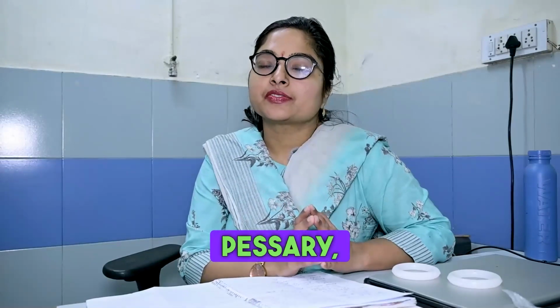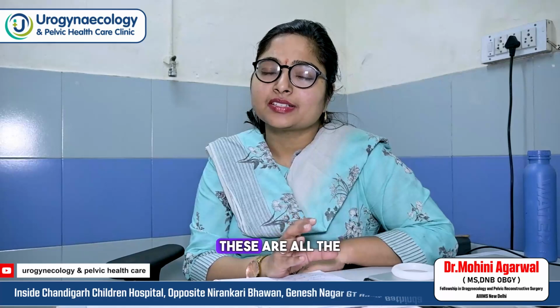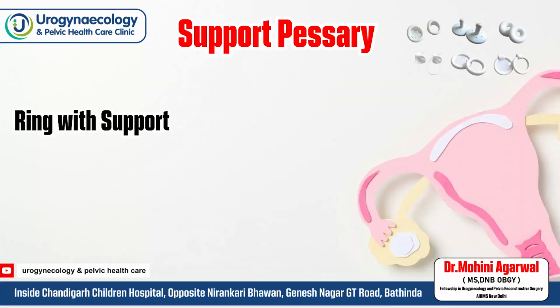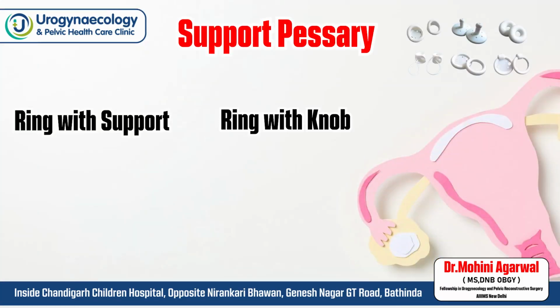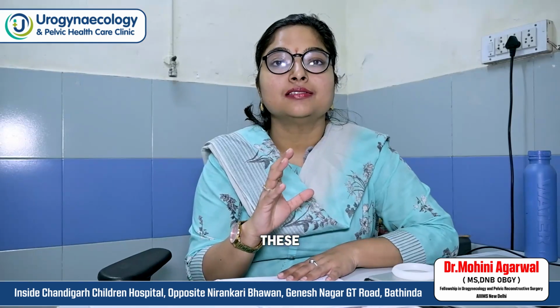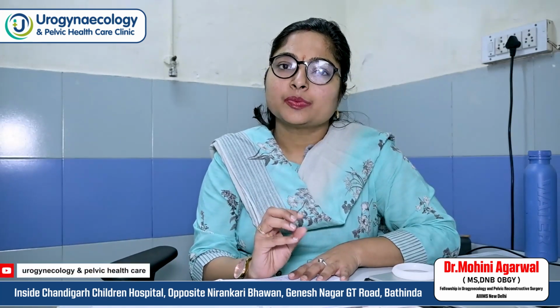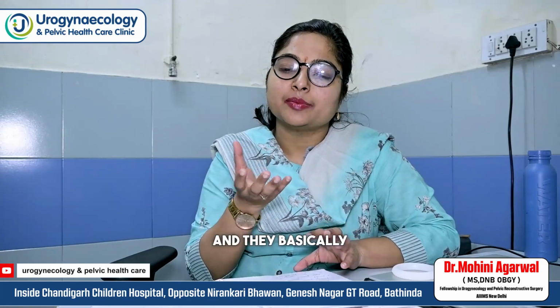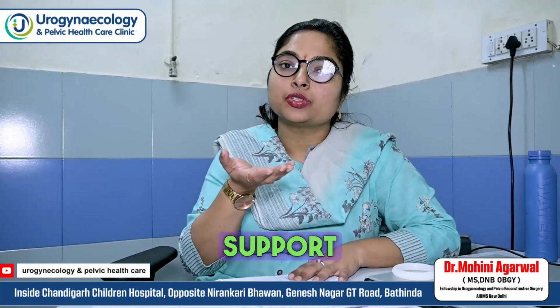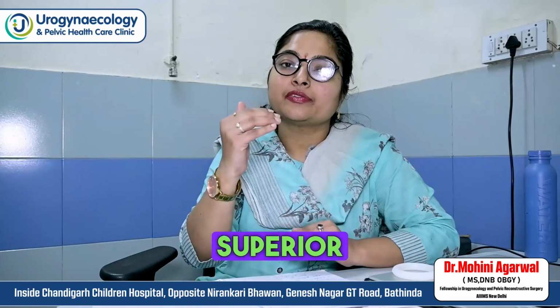So there are two types of pessary: support pessary and space filling pessary. Support pessaries are the ring pessary, ring with support, ring with knob, Schatz pessary, Gellhorn, and Hodge pessary. These are the support pessaries. They basically have a spring-like action. They act by a spring-like mechanism in the vagina, and they give support to the superior part of the vagina.